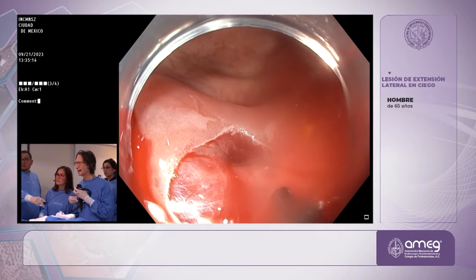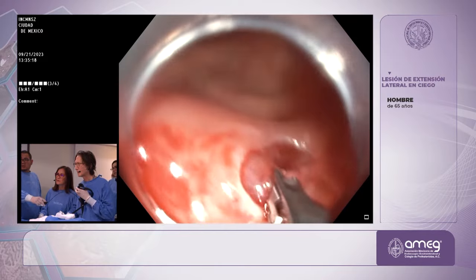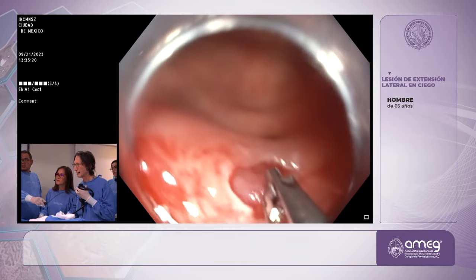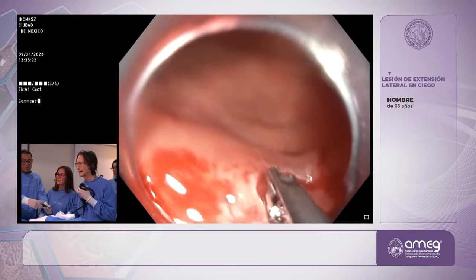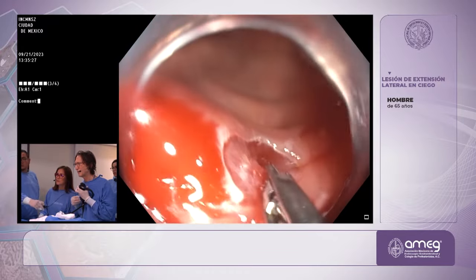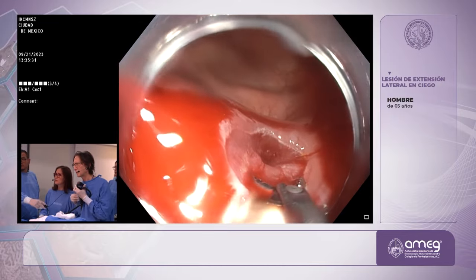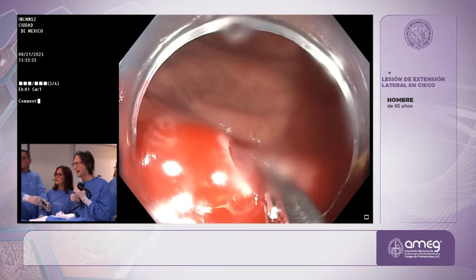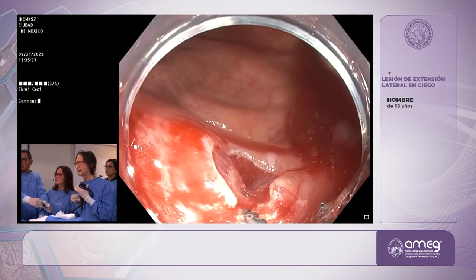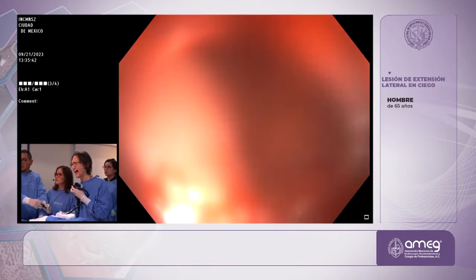We just have a little bit of oozing here, so let's see what we can do. Or you could use soft coag, which would be the other setting. Open the coag grasper. Abre. Abre el coag grasper. Close. Cierra. Close. Okay, open. I have to be really careful. This is how you easily perforate. So there's that. So let's look at this and see what happened.